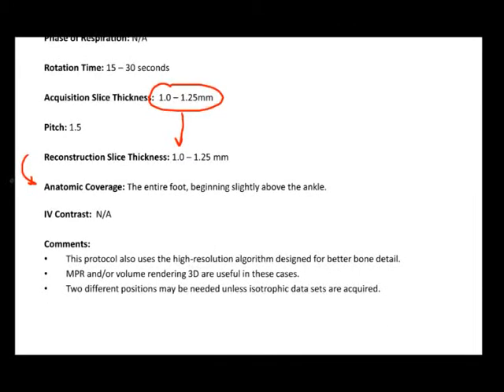The question then becomes, how do you actually scan the patient? Do you scan the patient with their knees bent and their feet flat, or do you keep their knees straight and have them kind of flex their foot up towards their head?